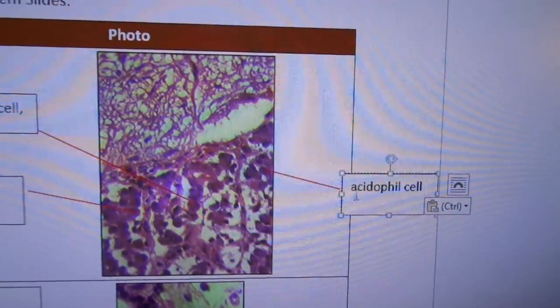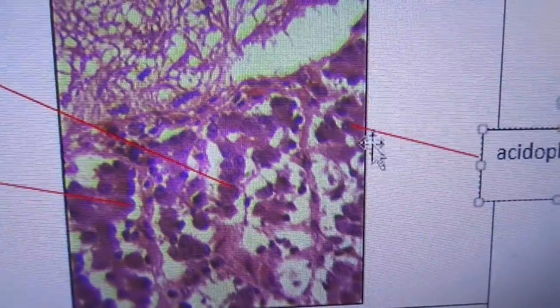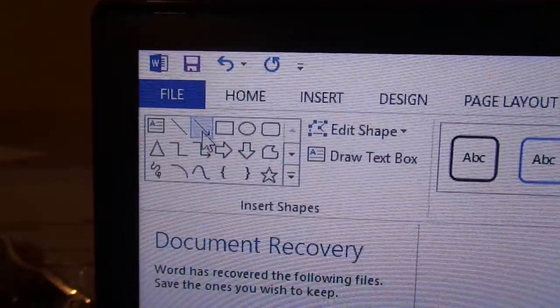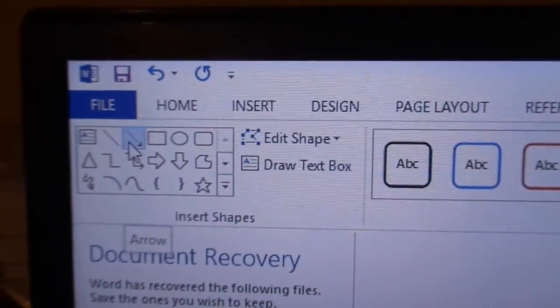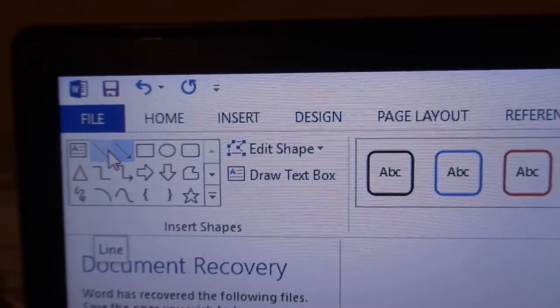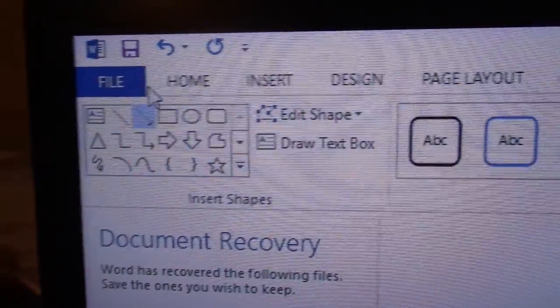And again, for the actual labels here for the cells, you can double click on the text box, and then it will provide you your options of how you want to label it. So I have often used this label as well with the arrow. I kind of go back and forth just depending on the histology and the slide in the lab. So I use these two the absolute most. But you can utilize whatever type of icon that you would like.